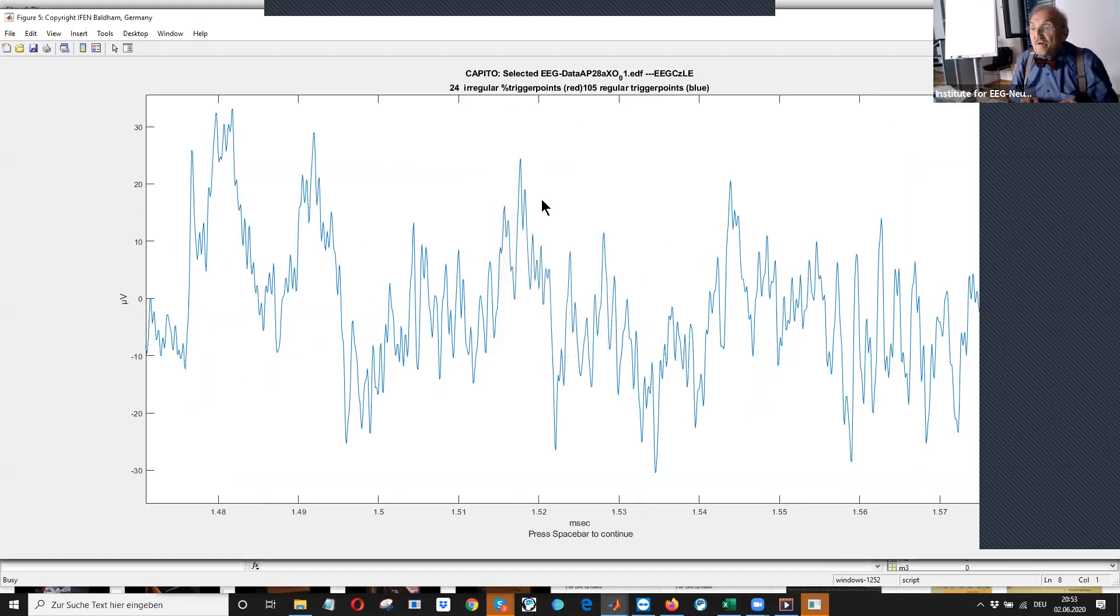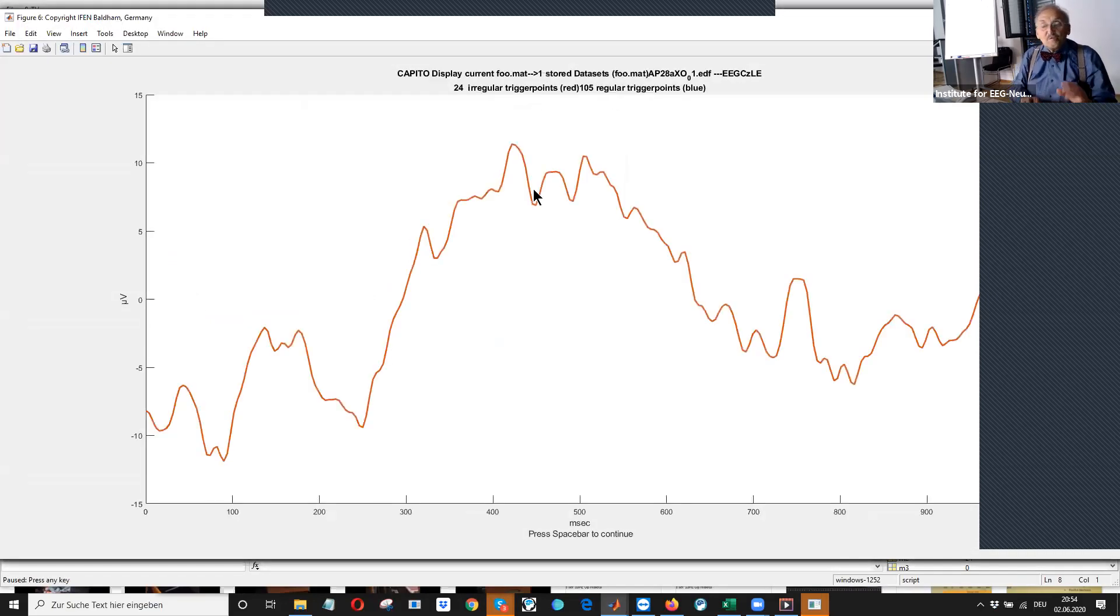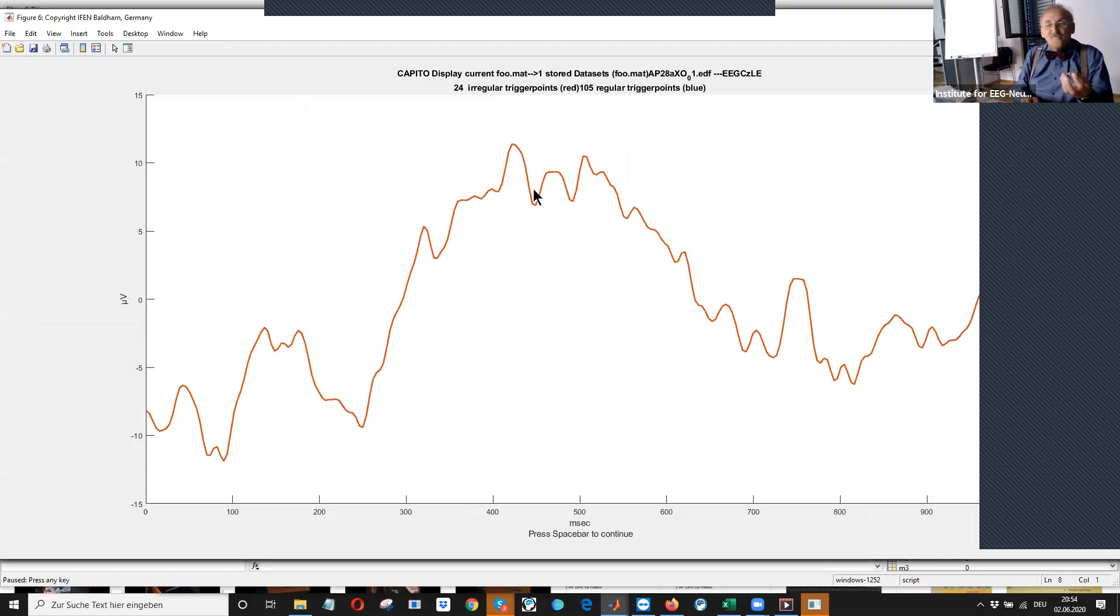We make our storage zero. We will store this and we will do the next, next two measurements and make the average of three trials.